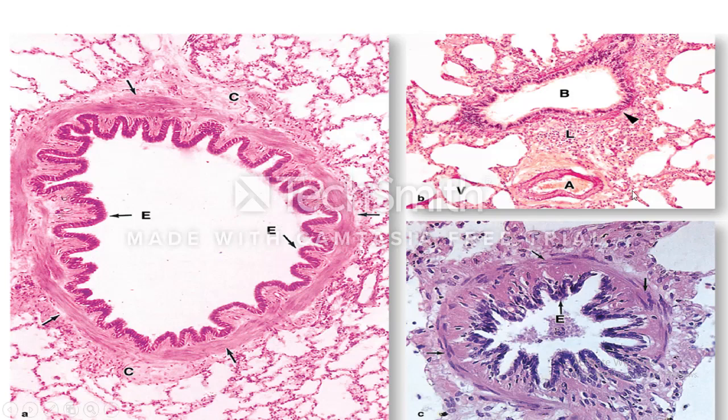This is terminal bronchiole. Why? This lumen is very reduced, a tube. Bronchiole, and near to this part, pulmonary arteriole. Pulmonary arteriole near to bronchiole shows this bronchiole is terminal bronchiole. Very good. This is a terminal bronchiole. This is a bronchiole. Okay, this is a terminal bronchiole.